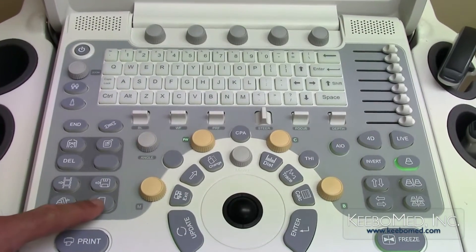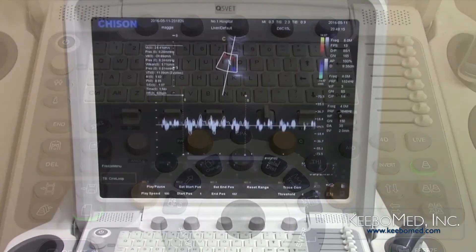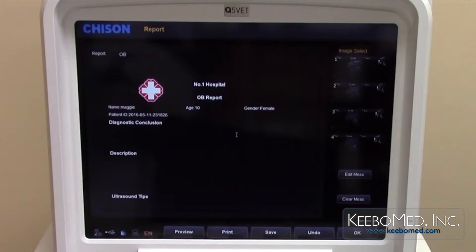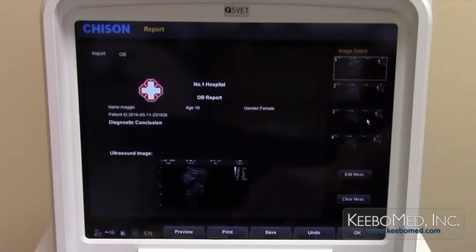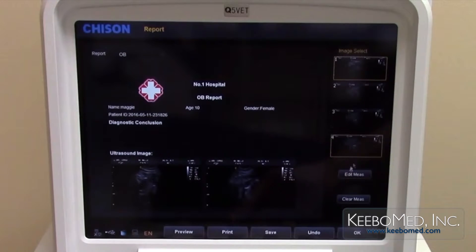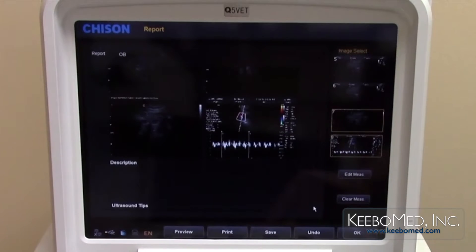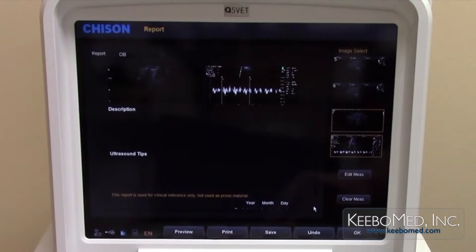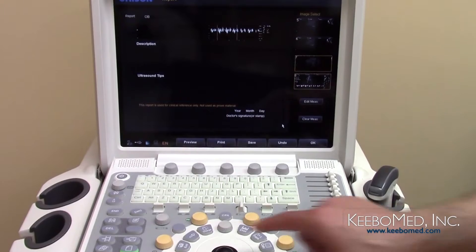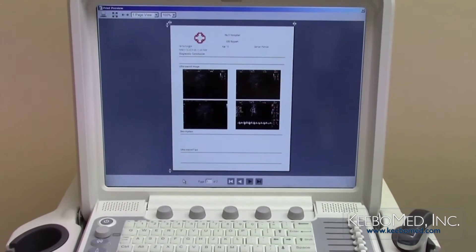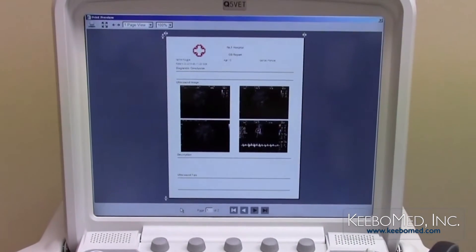Press the report key to enter the report screen. The report type and patient information will be displayed. As many images as needed can be added to the report by selecting images on the side of the screen. Descriptions and diagnostic conclusions can be typed in for each image. Press the preview button to generate a preview of the report before printing or saving, after which it can be saved or printed.